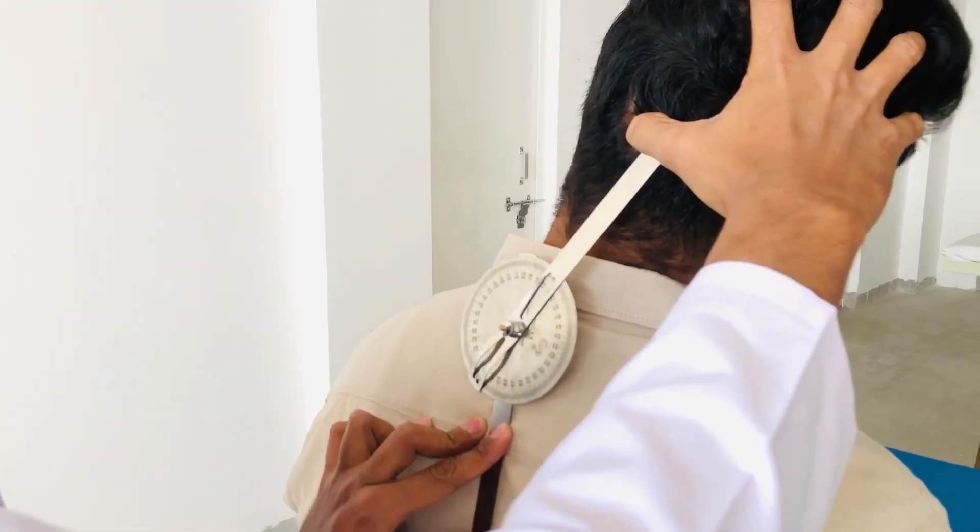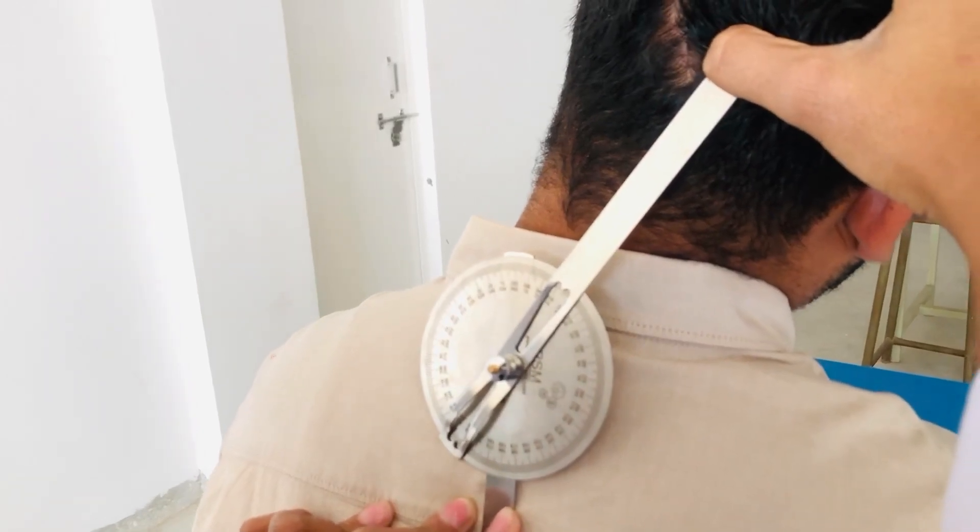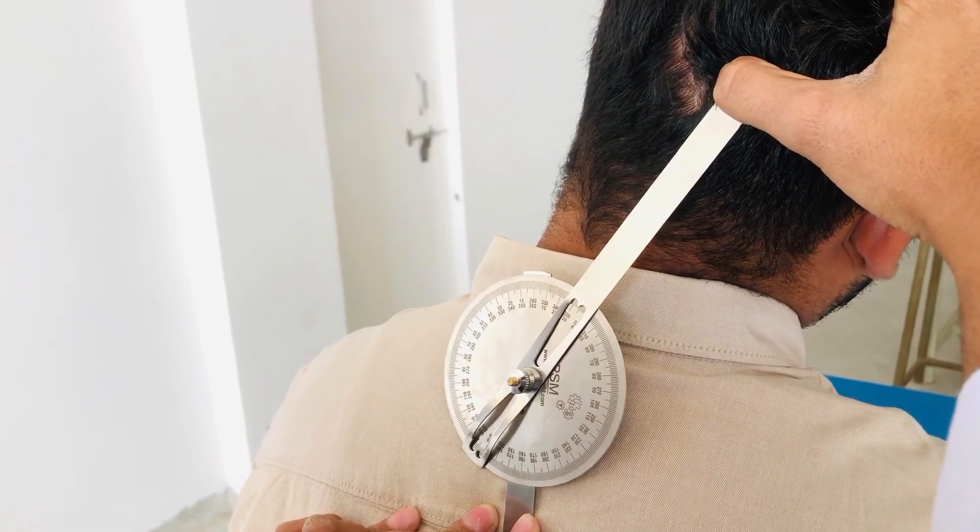You can see that it is going on 35 degrees. The normal range of lateral flexion is 20 to 45 degrees.